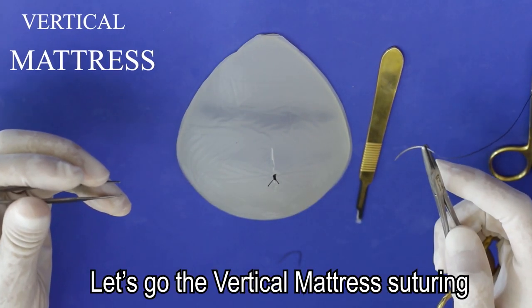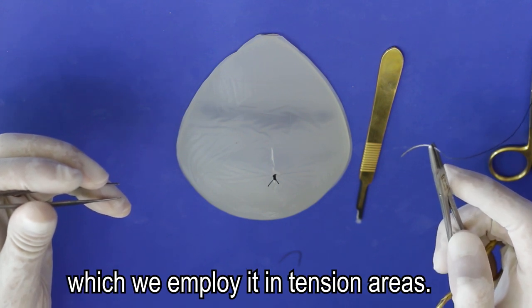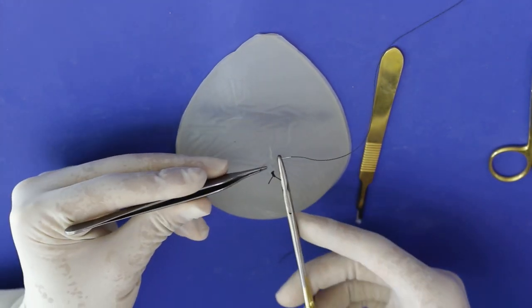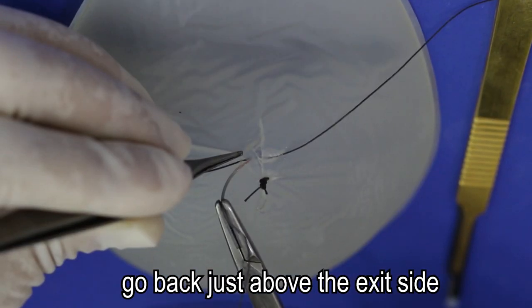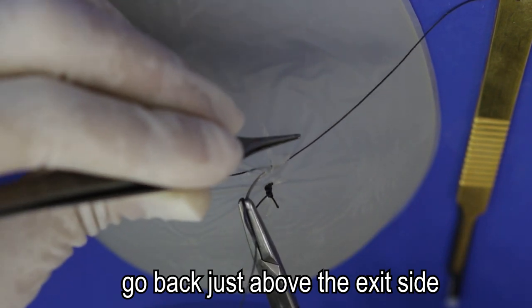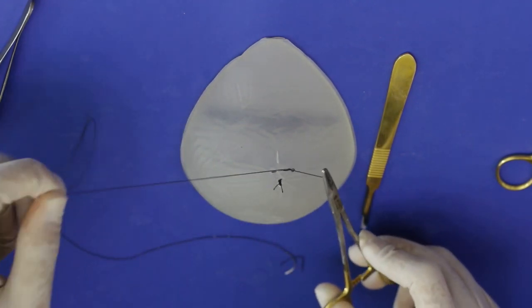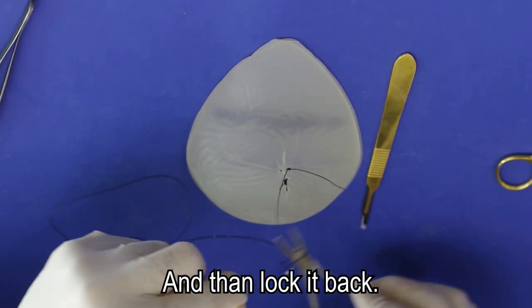Let's go forward to the vertical mattress suture, which we employ in tension areas. This time, you go through the wound and then go back just above the exit side again. And then knot it back.